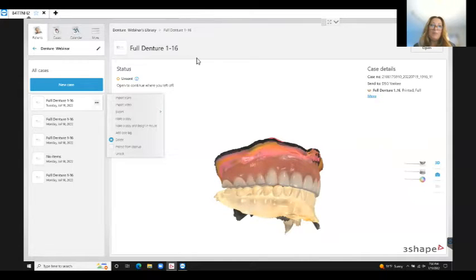even though your mouth dries, the tissue becomes more shiny. And it is a camera, right? Any scanner is a camera, and you get almost overexposure. So that's why sometimes it's hard to scan them. But don't give up. Don't let your scanner become a paperweight in the corner. Just keep at it. You'll get it.